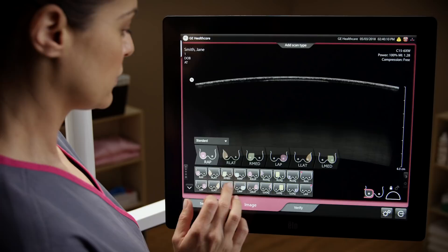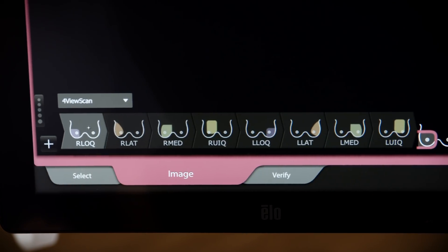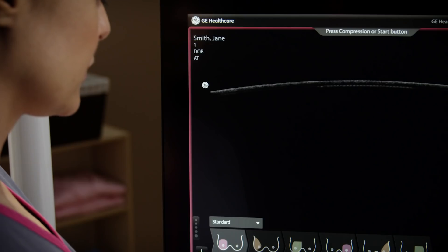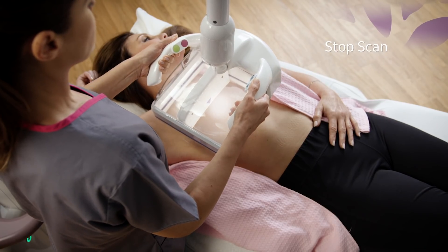With intuitive graphics, users can customize protocols and take additional views for larger breast sizes and implants. For patients with smaller breast sizes, the acquisition can be shortened with the stop scan feature.